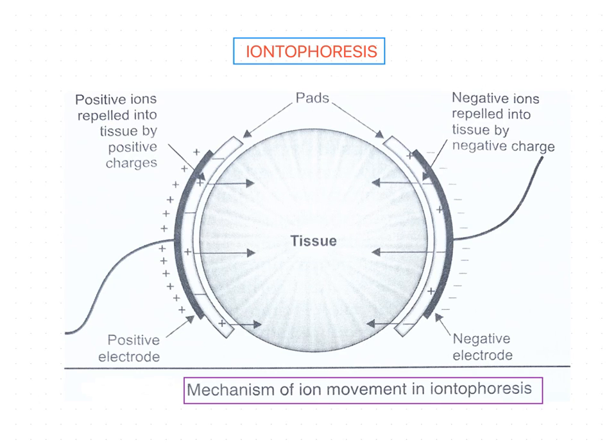Dear students, welcome back. In this session, we are going to discuss the mechanism of iontophoresis.